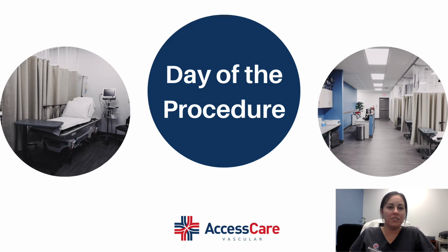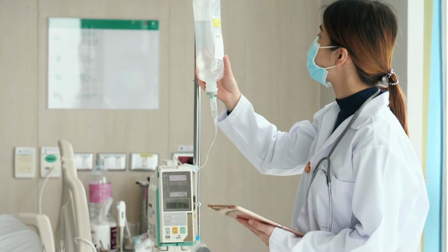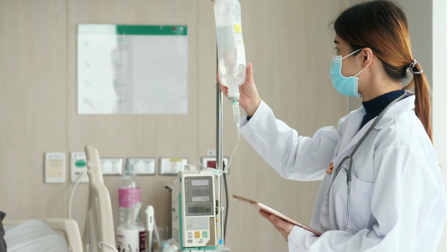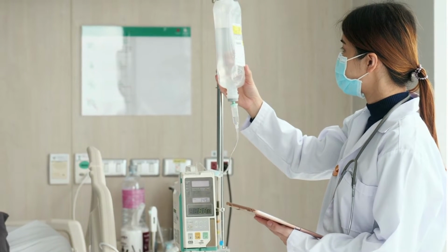So on the day of your procedure, we will have you get dropped off about 1 hour prior to your scheduled procedure time. When you arrive, you'll be met with our clinical staff and taken back to recovery, where we will check you in. Check-in includes paperwork. We get you all settled in, we talk about the procedure, and we get an IV going for hydration, and that's how you'll get your medication. After we get you checked in, we'll then bring you into our procedure room, where we will get you prepped for your procedure, and we'll start your conscious sedation.